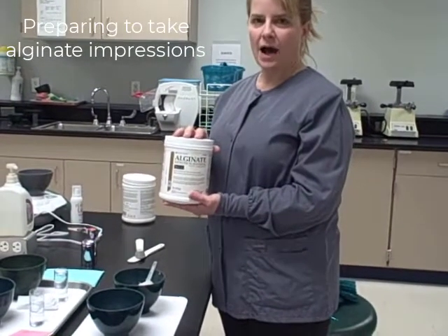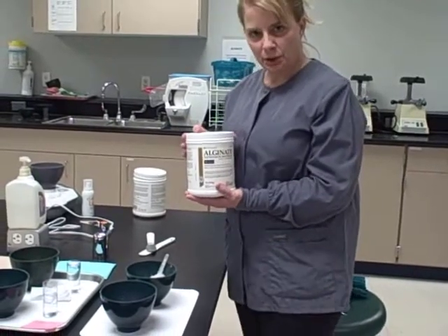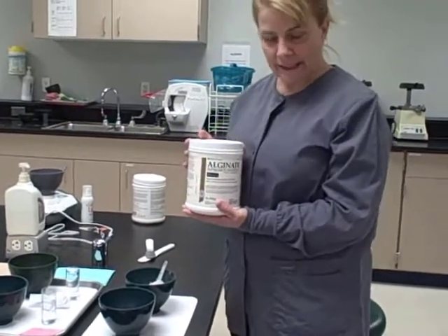Today we're going to demonstrate how to take an alginate impression. We're going to take a maxillary and a mandibular impression, and we're going to do a wax bite.